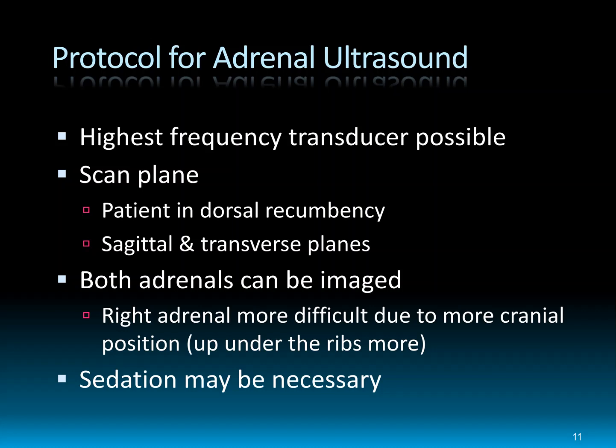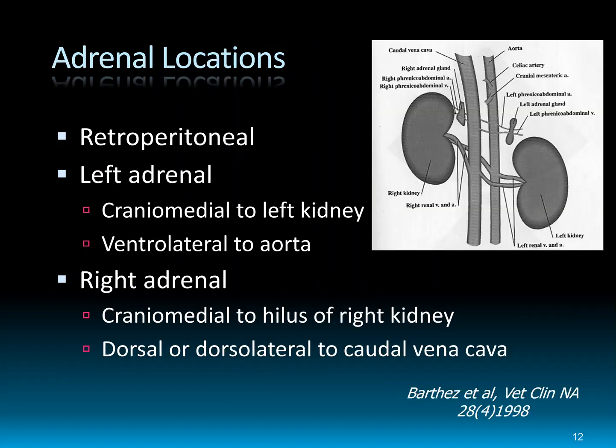You can image both adrenal glands, but the right one, like I said before, is a little bit more difficult because of its location, and so sometimes it's tougher to get a nice image of the right adrenal gland. And also, like I said before, you may need sedation in a given patient. Again, a lot of times not, but it just depends on the critter's temperament.